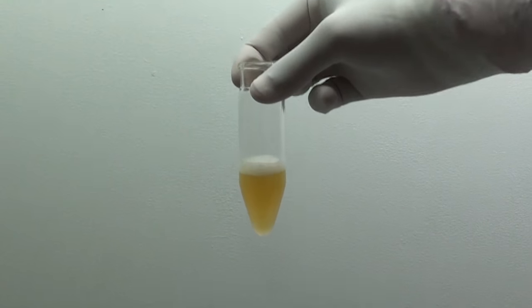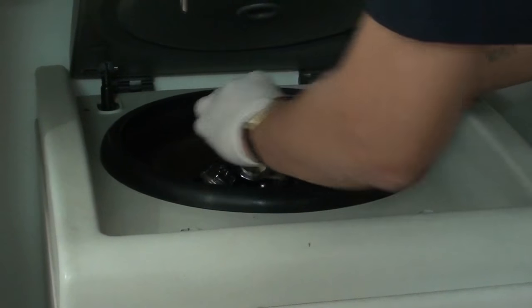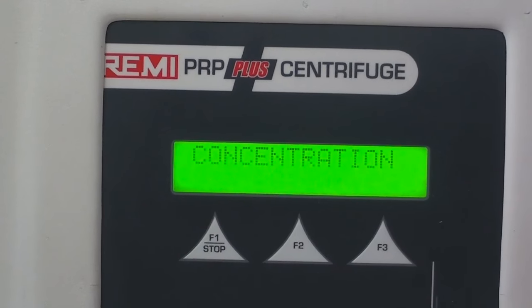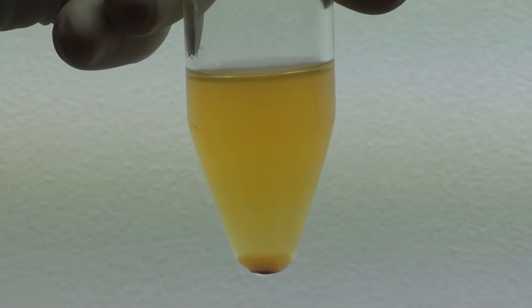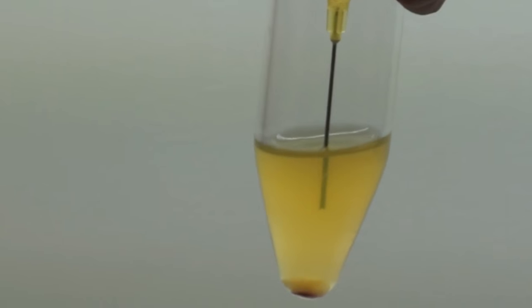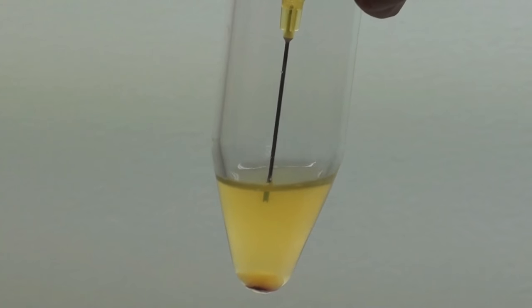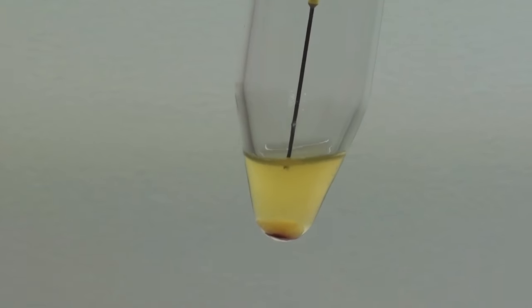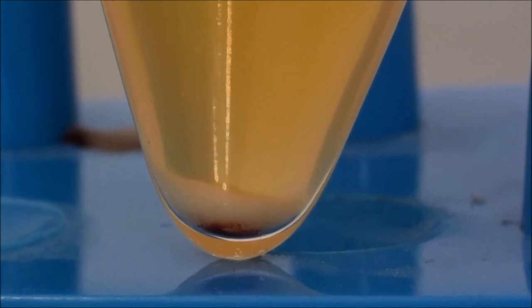Now this plasma is again centrifuged for concentration in our machine — the timing is 8 minutes — in which platelet concentrate is prepared. You can see the concentrated platelets sitting at the bottom. Take out the extra plasma and leave around 2.5 to 3 cc of plasma.